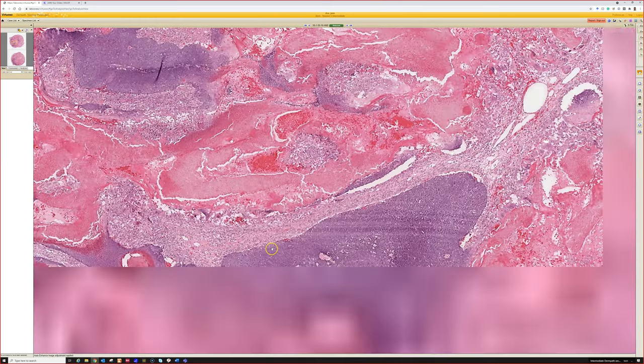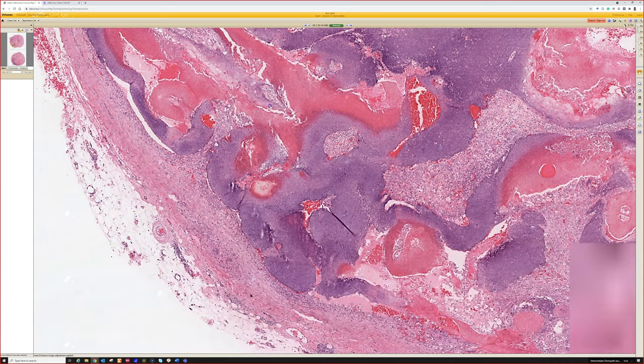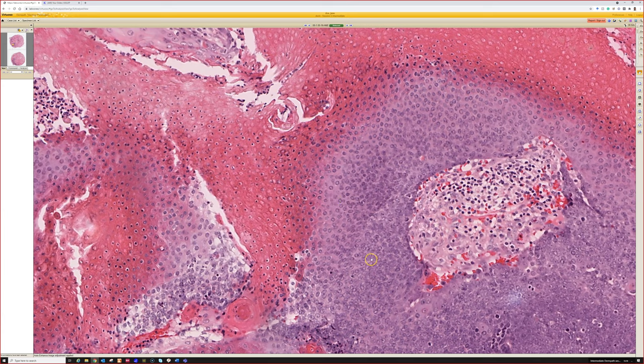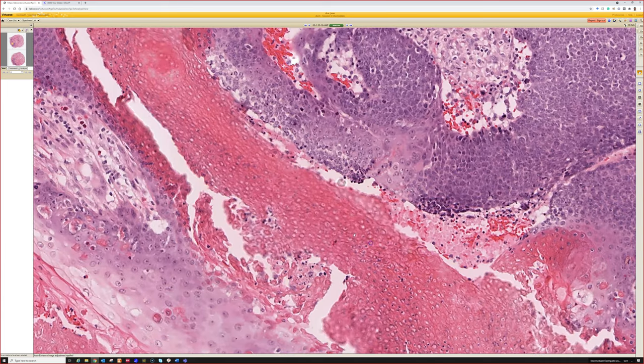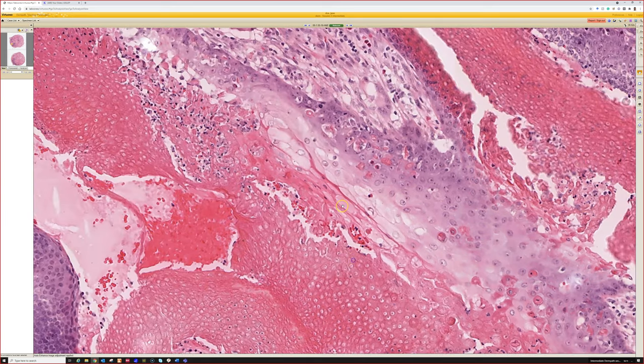And the other thing is they can have actual necrosis. Here you can also see sometimes the transition. See how you transition from the blue matrical cells and then they get kind of pale, then the nuclei get pyknotic and shrunken and dark, almost black looking, and then the nuclei disappear and you transition out into the dead sheets of shadow or ghost cells. So that's exactly how the process happens.